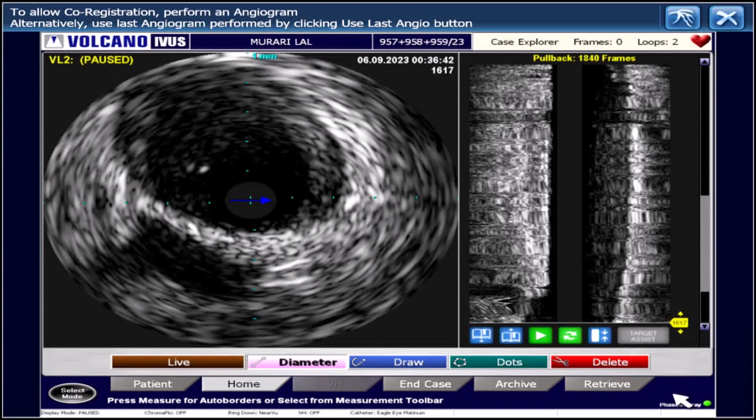So I think if there had been significant plaque, we would have gone with LM to LCX. But in this case, probably considering that he had an anterior wall MI just 3 days back, I think it's better for the patient as well as for us, frankly speaking. So the point is whether we will be able to nail the ostium or not. That's the only thing now.